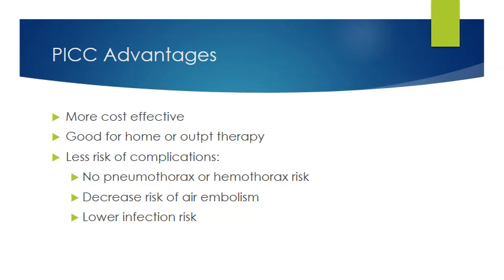They also have a lower infection rate. So think about that for just a minute. Why would a PICC line have a lower risk of infection versus a central line that was placed in your neck or in your chest, or if you had a femoral line in your groin? So pause this, think about it, and come back and see if your thoughts were correct.